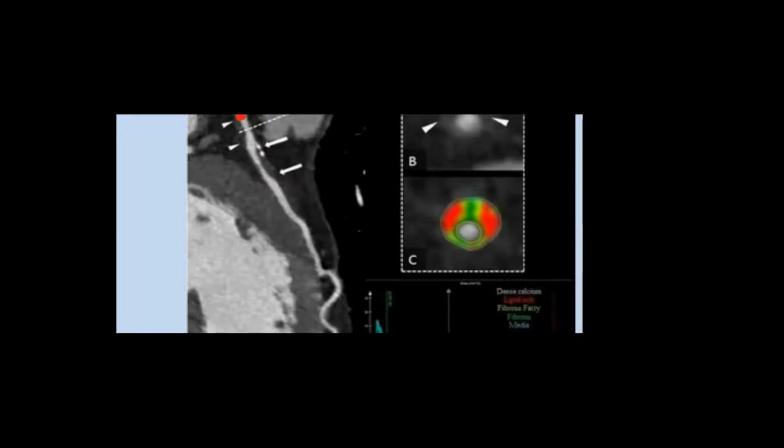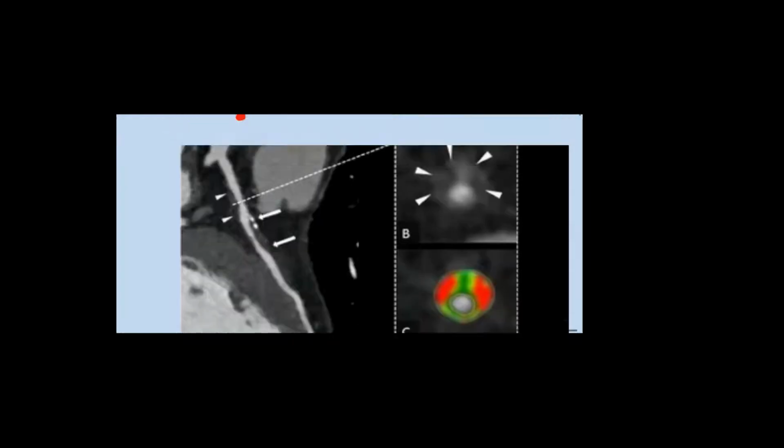Excuse me, sir. Sure. Yes? If I take all the diameter, the diameter of the vulnerable plaque or of the plaque with the inner lumen, with the open lumen, the ratio will be 1 to 1. No, I should not take it with the inner, with the wall.